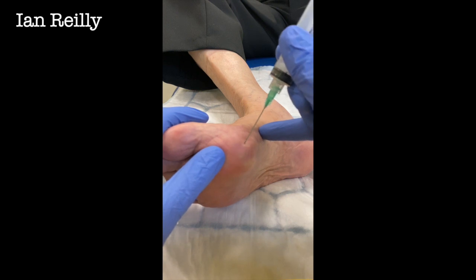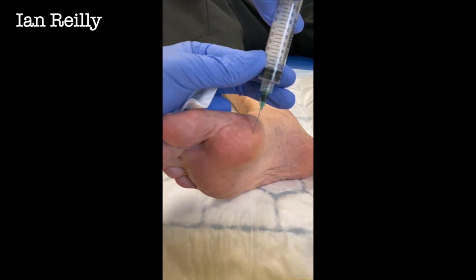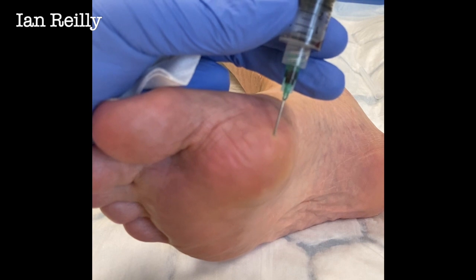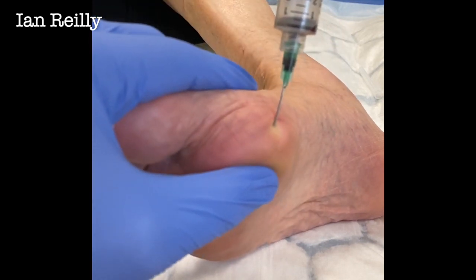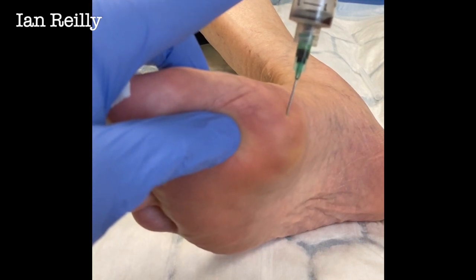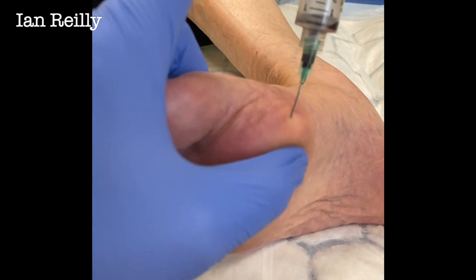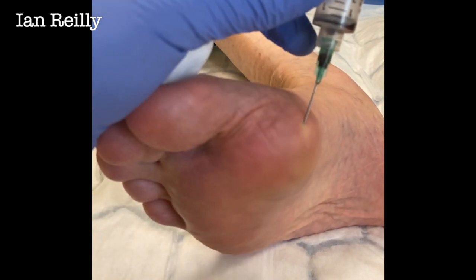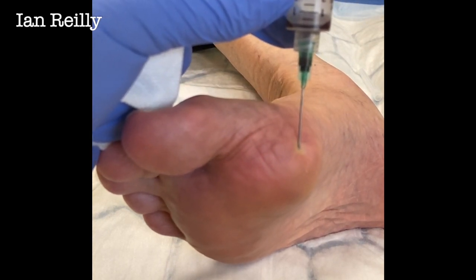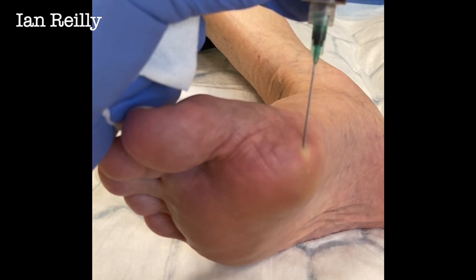Let's see if we can get anything off. That's interesting - it's kind of a little bit on the pinky side, that one. That says to me there's quite a bit of... interesting. That's quite bruising there - you can see that's coming out, not as pure bursal fluid. Sorry, sir, don't pull a face - thankfully he's got a mask on so I can't see the face he's pulling.